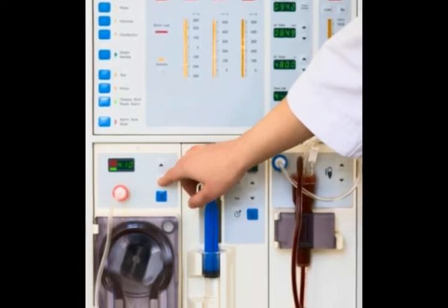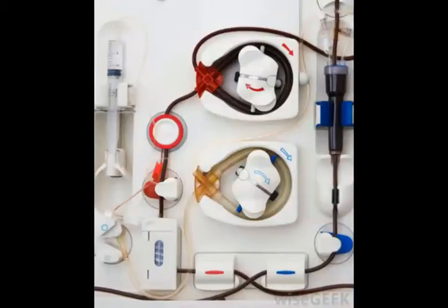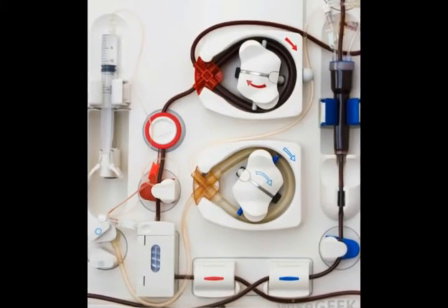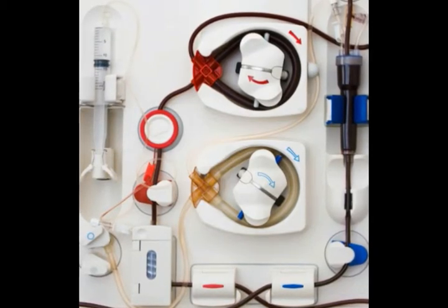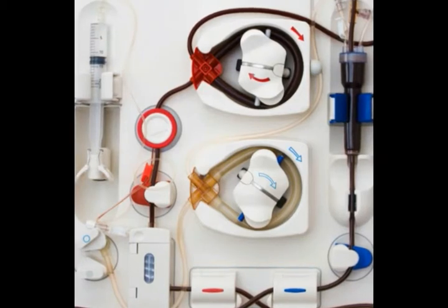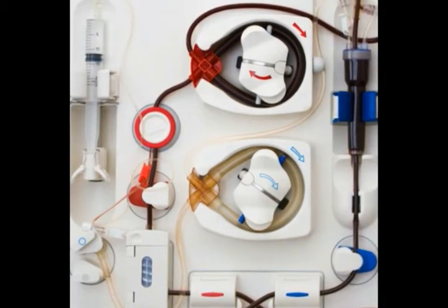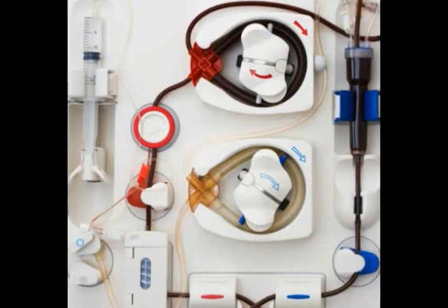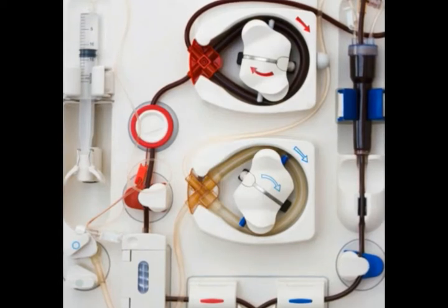Particles naturally spread themselves out from areas of higher concentration into areas of lower concentration if allowed to do so, a process called diffusion, and dialysis exploits this process. As blood flows through the dialysis tubing, waste product molecules concentrated in the blood diffuse through the semi-permeable tubing into the solution in the dialysis machine until their levels in the blood and dialysate are in equilibrium.